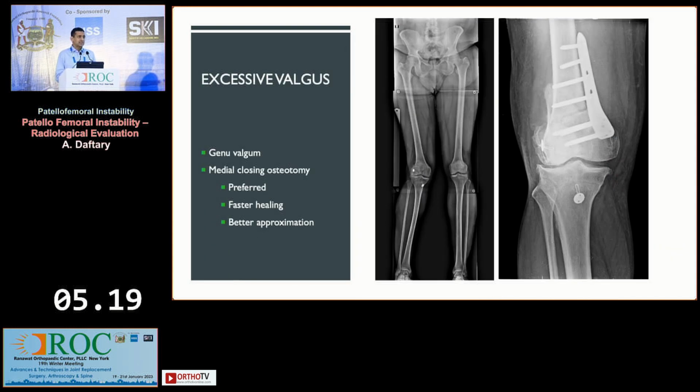Excessive valgus is something, in our practice, I think Bhushan does a lot of the work, where we look at excessive valgus, we get scanograms very often and do the measurements for your LDFA. The decision making is definitely not in the syllabus that I studied, but somewhat. Essentially, you could pick between a medial closing osteotomy, such as this patient.